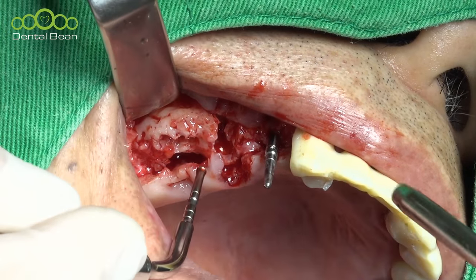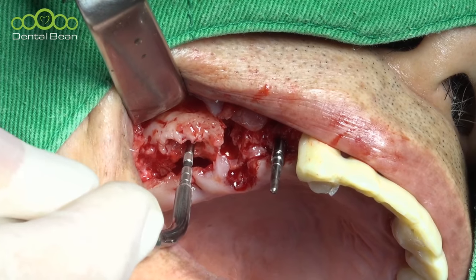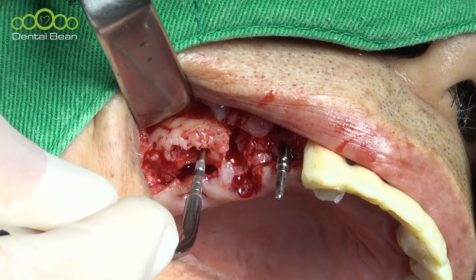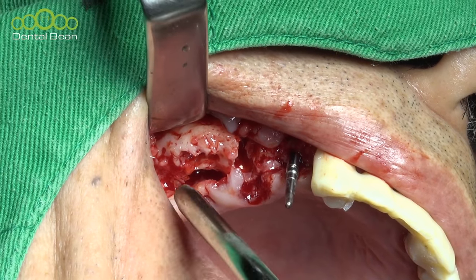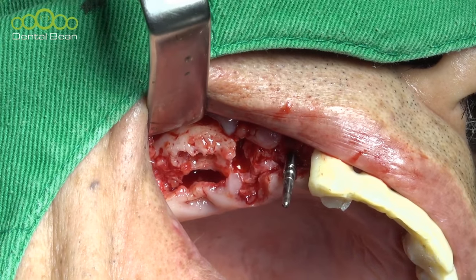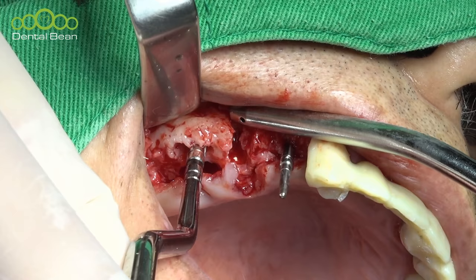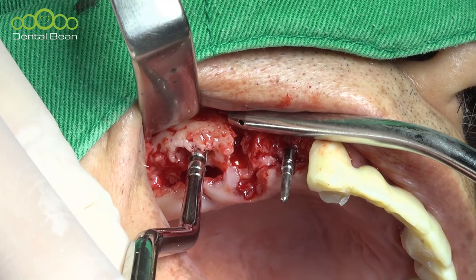At the time, the depth gauge is scratching the bone wall, scratching the distal lingual bone wall, the labial bone, distal, medial here. Okay, not perforated yet. So very carefully, additional, right here. Very soft force. Okay.